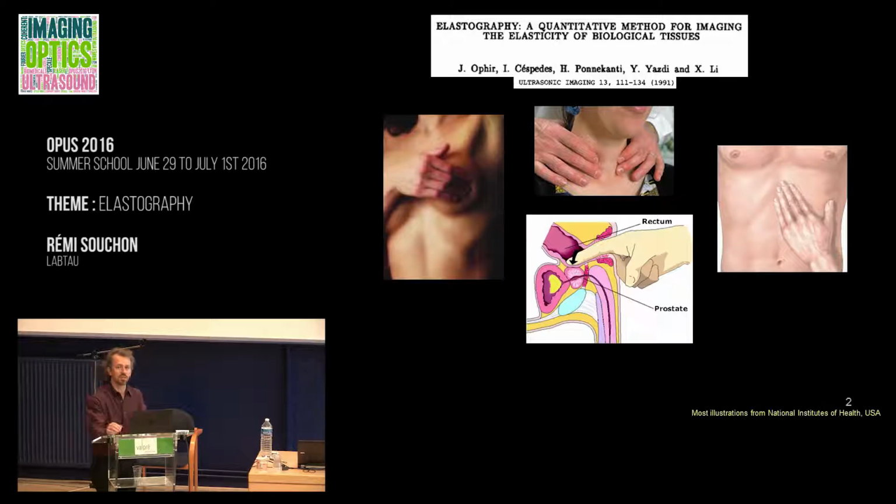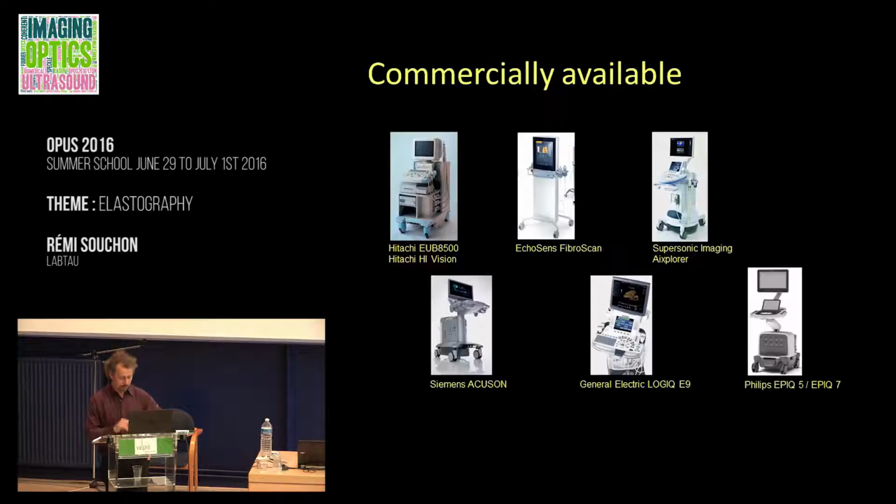This is the case, for example, of fibrosis or cirrhosis in the liver, where the whole liver, or a major part of the liver, can be affected by cirrhosis or fibrosis and get stiffer. And that's actually why medical doctors exert palpation on the liver to feel the stiffness, and it can tell basically how much you've drunk. But these techniques are basically subjective and not quantitative, so there's been an urgent need to develop techniques. It's been done over the last 25 years or so.